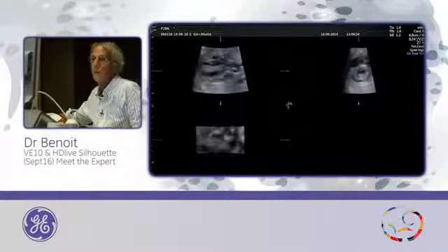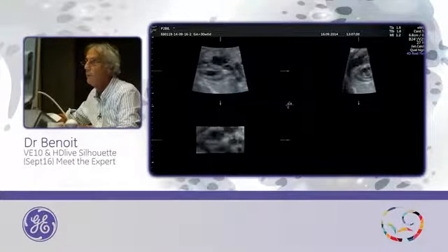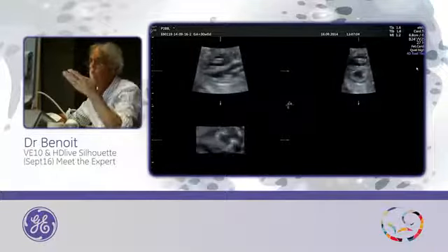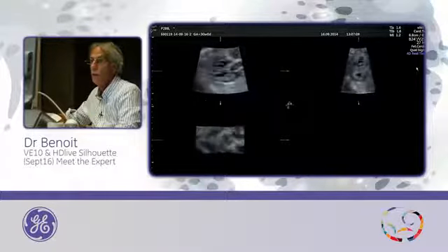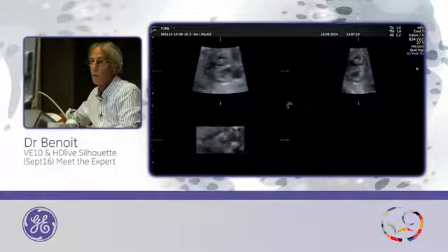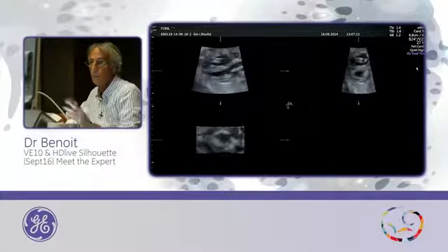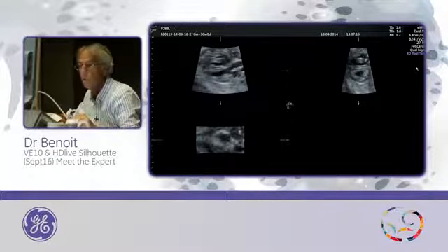This is real time, with a frame rate of 27 volumes per second. That means here you can do one examination like this. You can sweep, you can save it, and now you can play the loop.